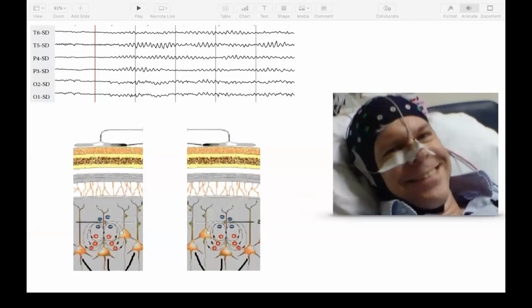And the nice thing is, if you have a lot of neurons chatting in this way, exchanging information, then it allows us to measure part of that activity, in particular from the neurons in the cortex, with an EEG. So apparently this continuous counting of the votes is associated with the intraneuronal currents and giving rise to periodic rhythms, as is illustrated here on the top. And so essentially with an EEG, we are listening to the communication of the neurons, and in particular the neurons in the cortex of the brain.